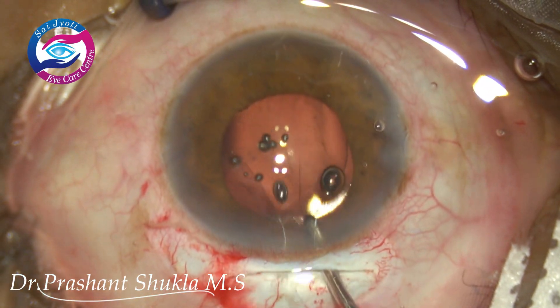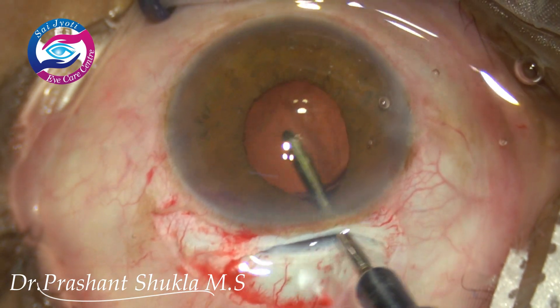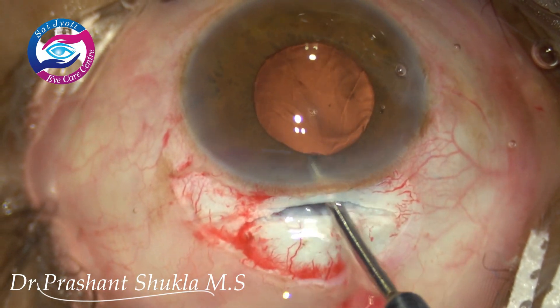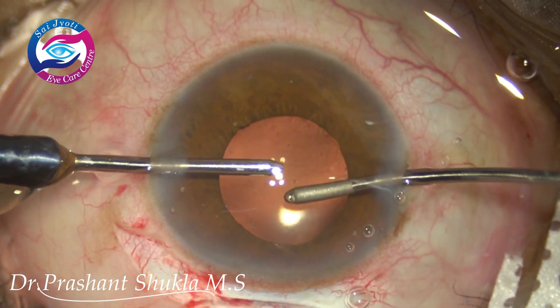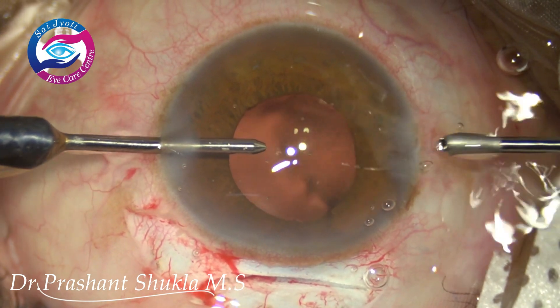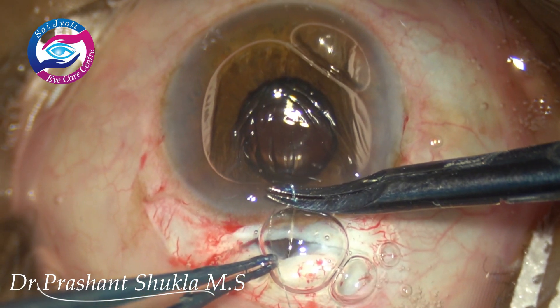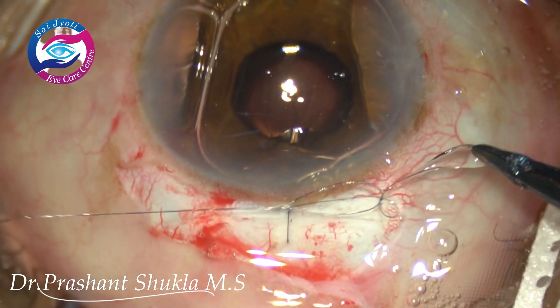Now is the time to remove the viscoelastic sodium hyaluronate from the capsular bag. I am using the irrigation handpiece to flush out the viscoelastic. As it is a small pupil, I am slightly hesitant to go behind the intraocular lens using the aspiration handpiece. Sodium hyaluronate normally gets removed very easily. The remaining viscoelastic is removed using the aspiration handpiece from the anterior chamber. Side ports are now being hydrated, and I am applying a single 10-0 nylon suture to close the wound, achieving a maximum of about 1 dioptre of astigmatism in my cases.